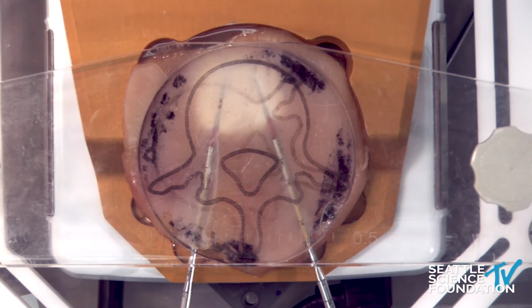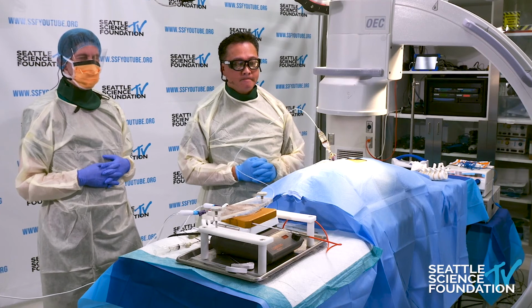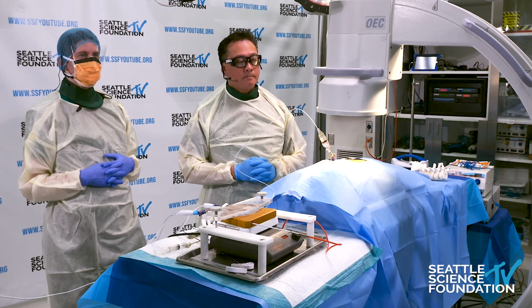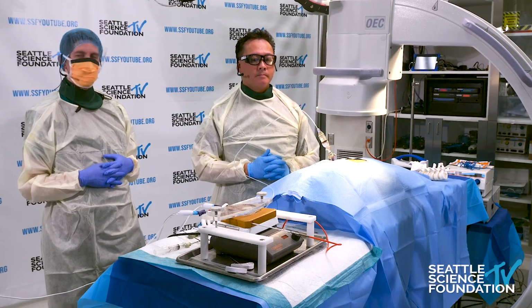You did a thermoablation on her. Very concerned patient. We really wanted to avoid surgery. 80% vertebral body destruction. I just saw her in clinic the other day, and she looks amazing. The CT scan 1 year out looks fantastic. I got to share the images with you. She's very grateful, very, very happy. So on this N of 1, this worked like a charm, I have to say.